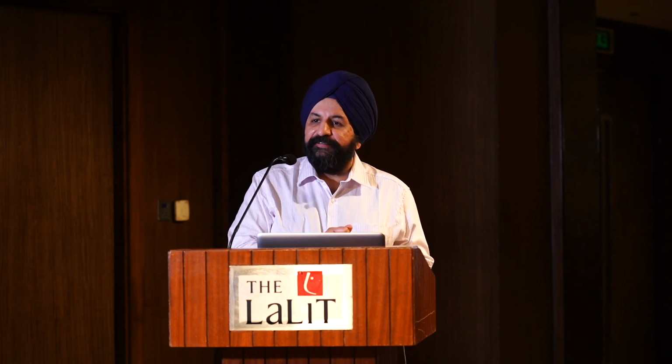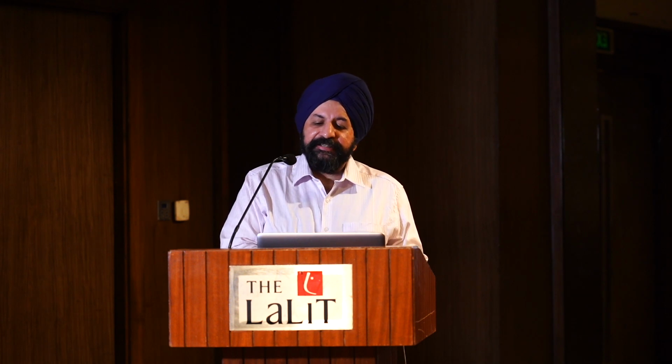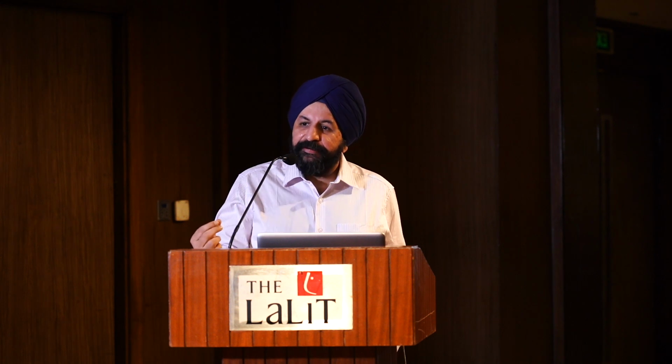Primarily it has 3 roles. A, it can be used for the diagnosis of iron deficiency anemia in adults and children. B, it is an early measure of response to iron therapy. Within 72 hours, it is the first parameter to elevate, much before ferritin, much before hemoglobin. And it is also an early indicator of iron restricted erythropoiesis in patients of anemia of chronic renal failure who are receiving erythropoietin therapy.